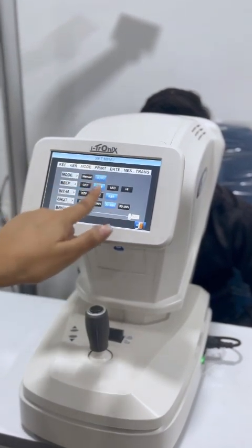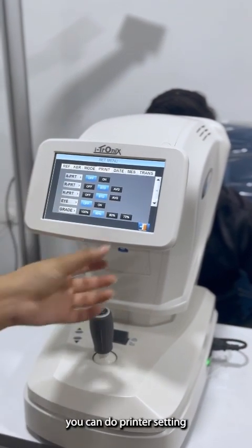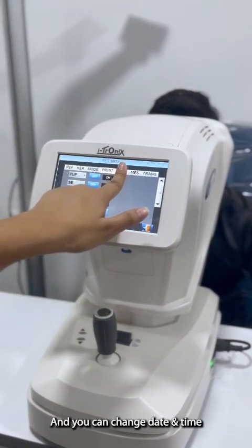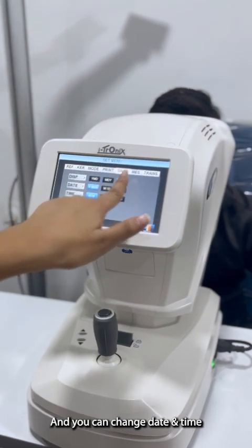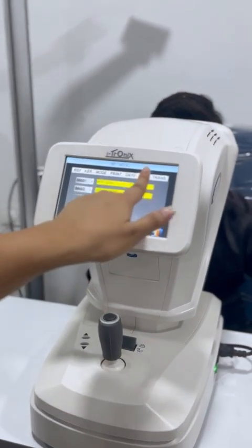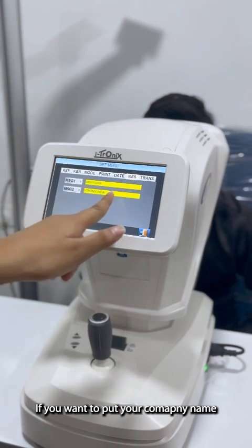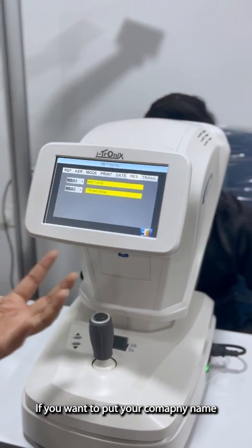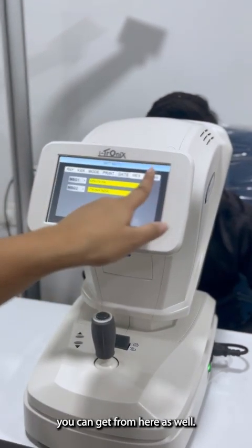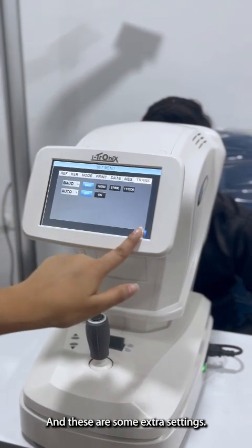You can set printer settings as well according to your need. You can change your date, time, and count from here. If you want to put your optical or clinic message, you can enter it from here as well. And these are some extra settings.